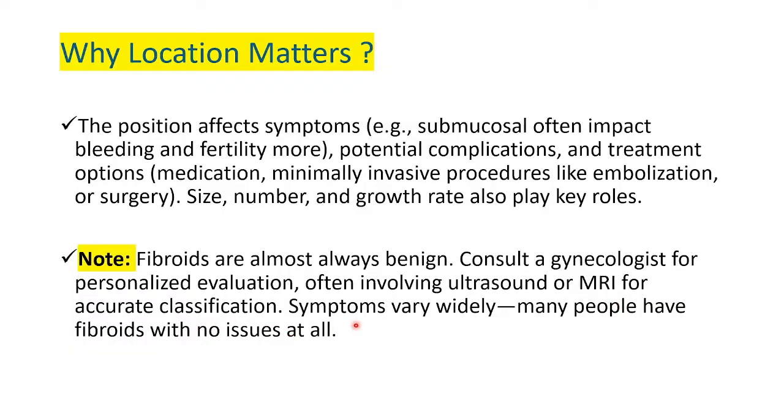So, ladies and gentlemen, this brings us to the end of our presentation on fibroids. I hope you understood the different types of fibroids that we have outlined or summarized.